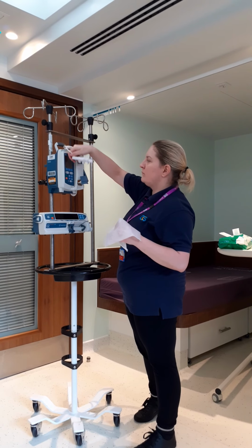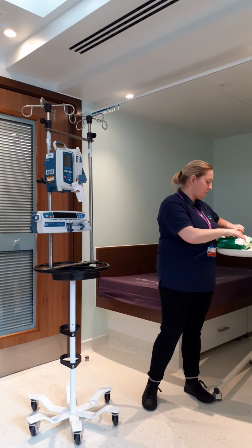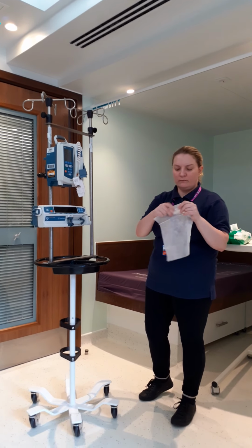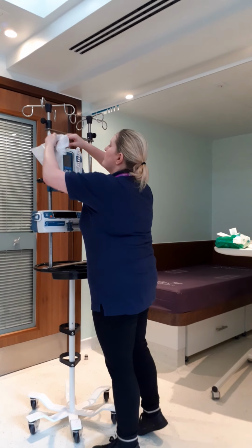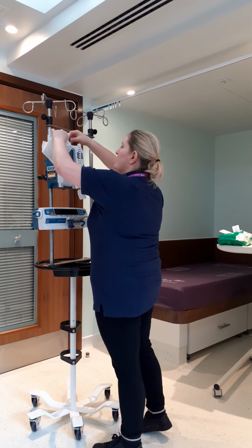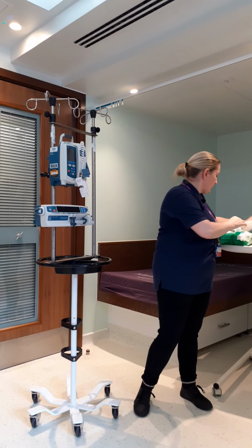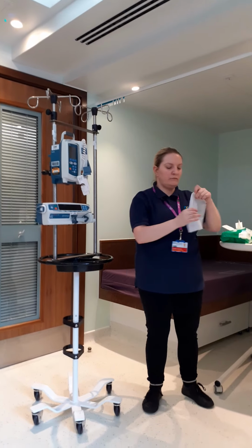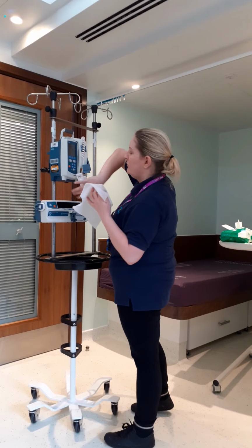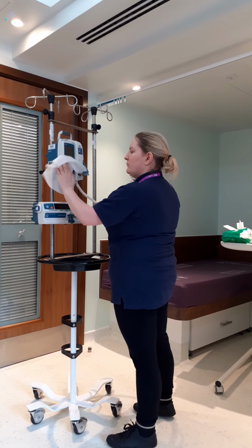The principles, although slightly different in terms of order in this case, are the same. We're using a single wipe per surface part of the pump. We're keeping it flattened out, and where possible, where the surface is flat enough, we're using an S-shaped motion. In those areas that aren't flat and easy to recognise where we've cleaned, we're being systematic, making sure that we know that we're cleaning one side first, then another, to make sure that we're not missing out on any of the key components.